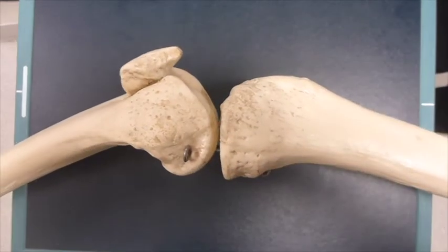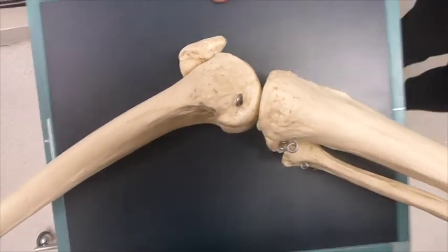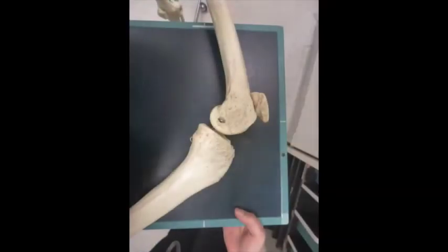We can see in this video how much a small rotation in the ankle or hip has on the condyles of the knee, and how this will affect the x-ray. This shows the correct positioning of the bones of a phantom for a lateral knee x-ray.